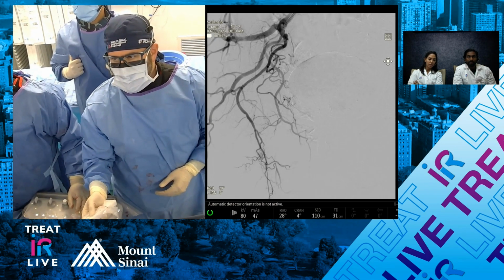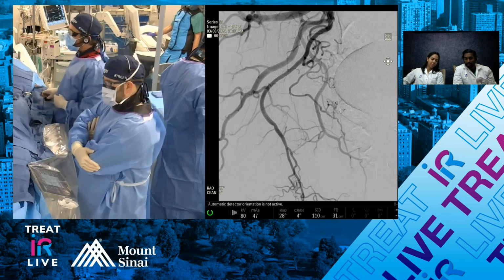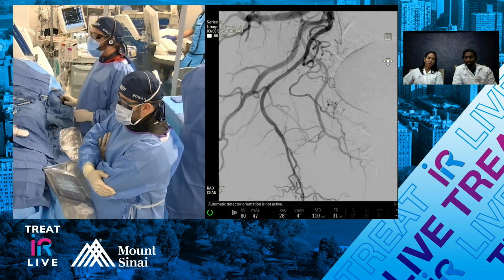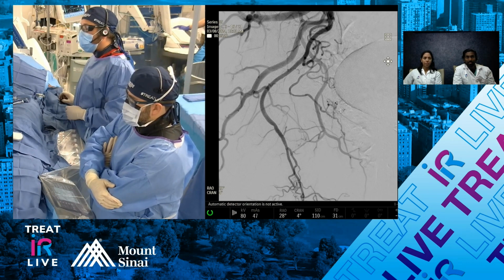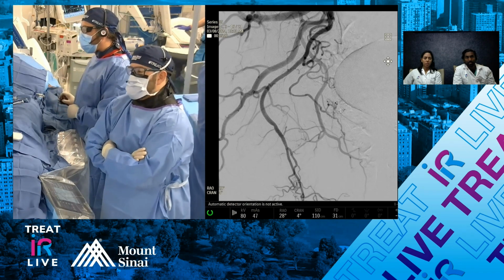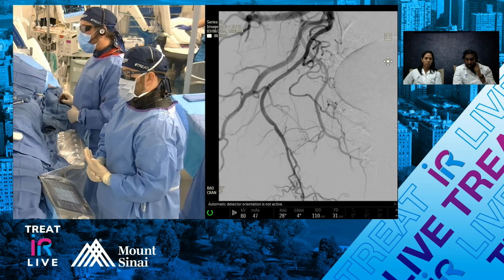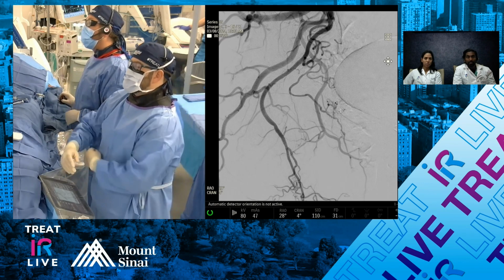Yeah, it's rectal. Are there any burning questions, anything in the chat that you think we should really try to address, or any burning questions that you guys have? The thin dilution, that's not really a concern. I haven't had that be an issue. What's more common with the thin dilution is that the glue actually travels too far up because it's so loose, and so you could theoretically get, if you're not careful, a lot of reflux, and it doesn't necessarily solidify until it's close to the base catheter, and then that's where you've got to be careful because you don't want glue in your base catheter, obviously.